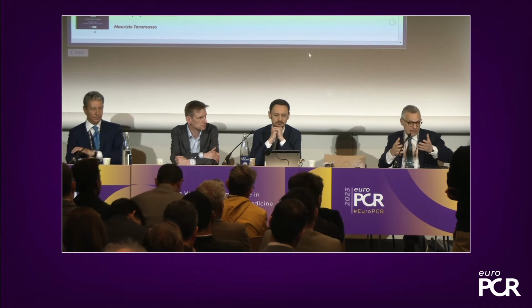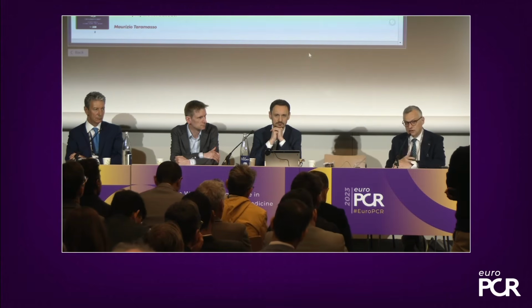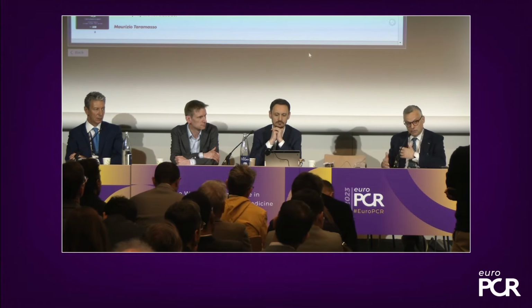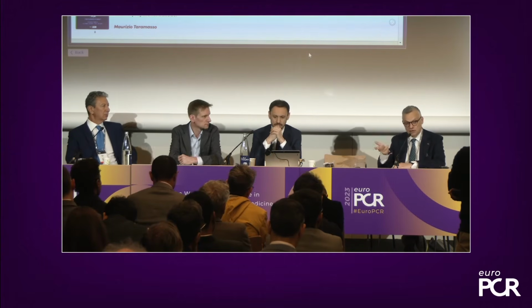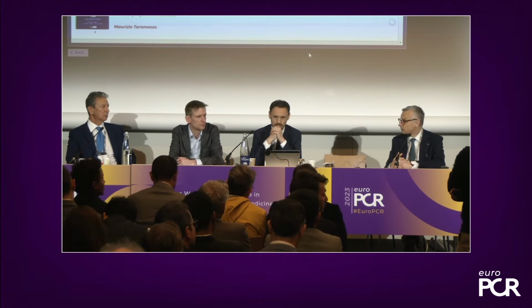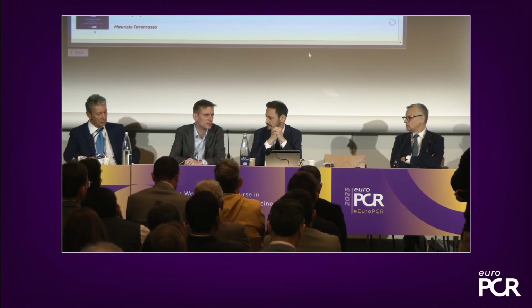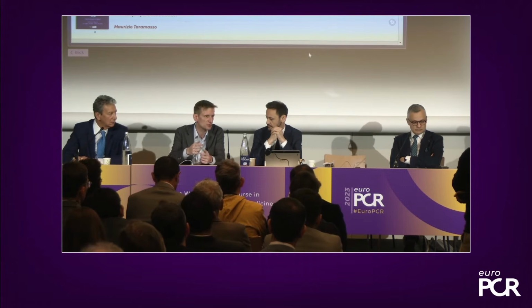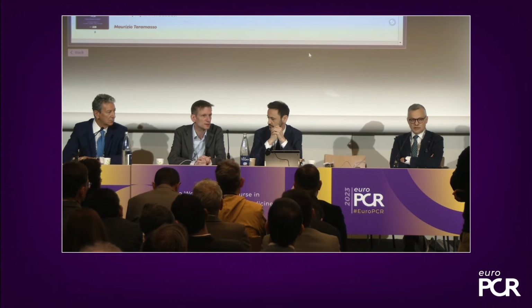So, I agree with you that you can have different approaches, but usually, also in my practice, I close one and then the second. But I don't check in between, to be honest. I've never had an occlusion, to be honest. And if I use two, I pull on both at the same time. So I don't think it has to do with that, to be honest. I think it has to do with where you shoot indeed the needles more.